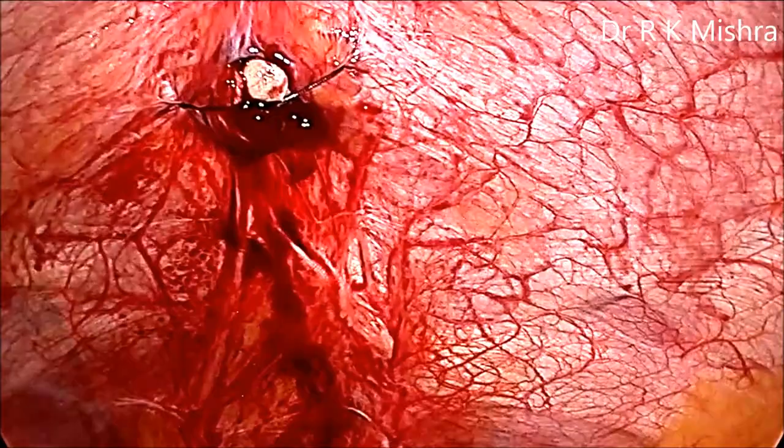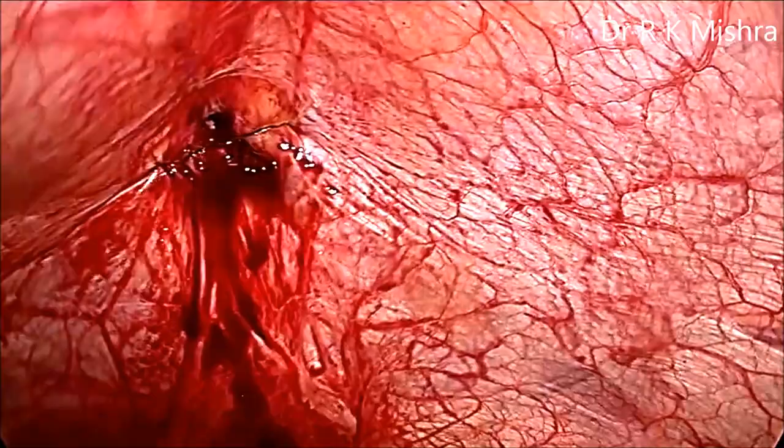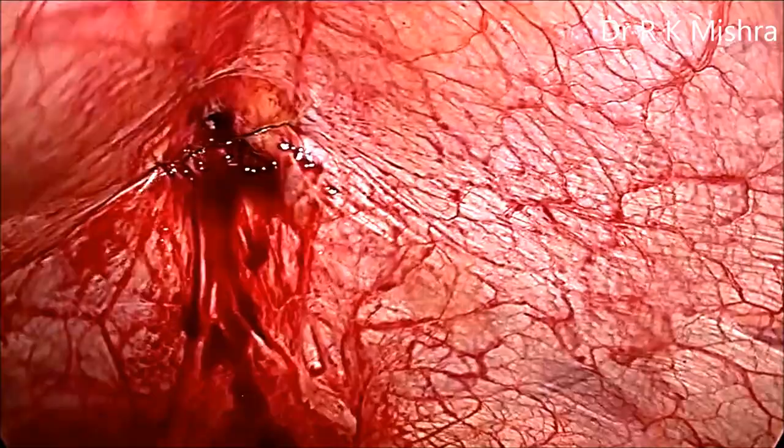We developed this technique in 2002, and now in all our laparoscopic cases, we use one Veress needle after removing the stylet to close the port.